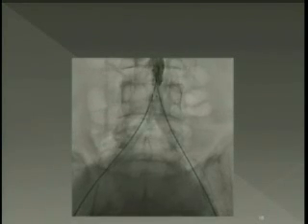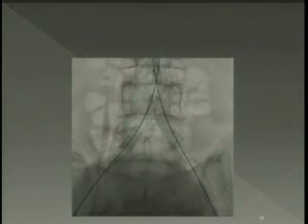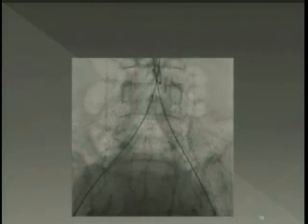Just 1 point. Yeah, 1.3, 1.4. I might just add that the Endologix company is, I think, going to make a unibody device that's only 20 millimeters of body that will sit on the bifurcation, which they're going to market for a very low price, something very competitive to putting in three stents.